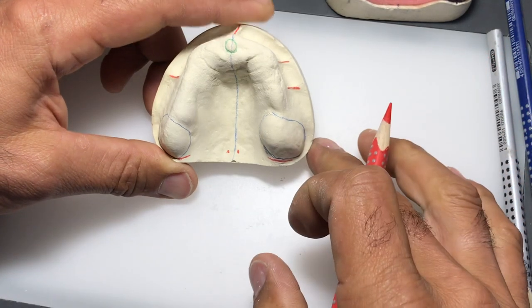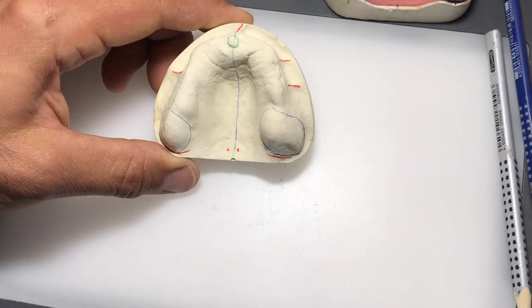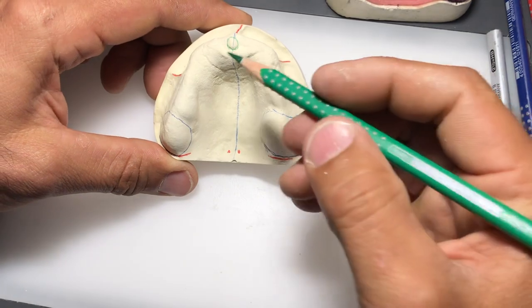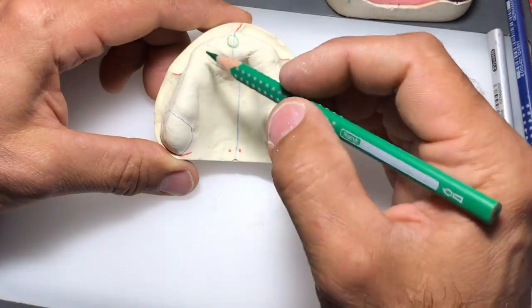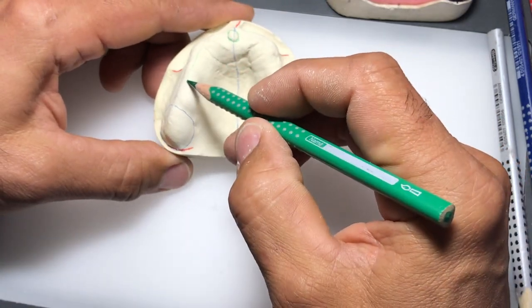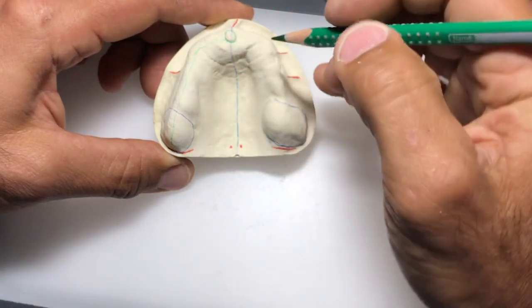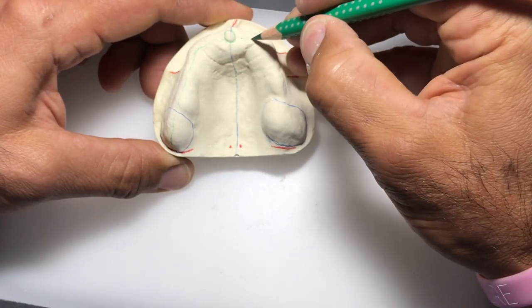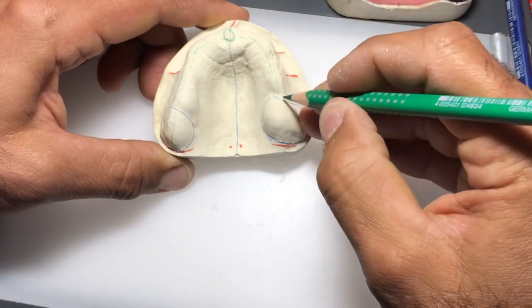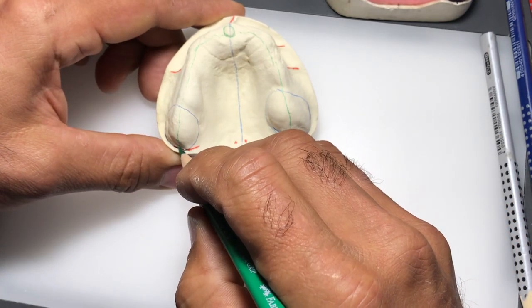In order to fabricate our custom trays properly, we can also identify the crest of the ridge, which is the highest portion of this residual ridge. You can just take your pencil and make an outline along the highest point of the ridge all the way back to the hamular notch.